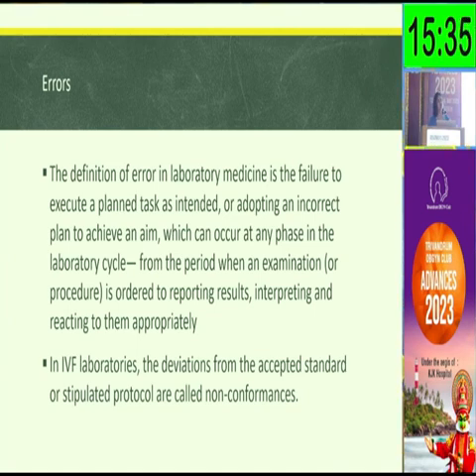Every time we make even the smallest deviation from the accepted standard operating procedures, we make a note of it in our master note so that we know what the effect of it is. Sometimes the deviation that we have made has given us better results, and hence we continue to make the deviation, which in turn gets incorporated in the SOP as the standard protocol.